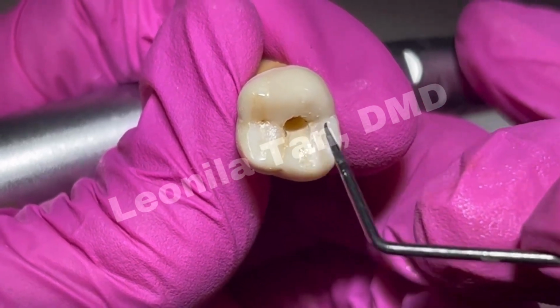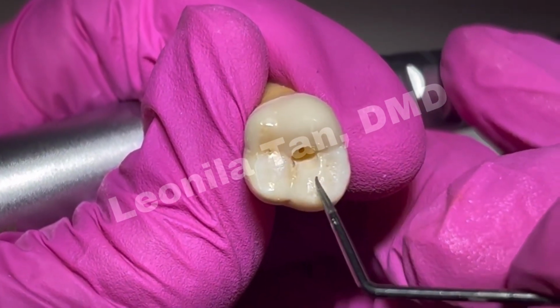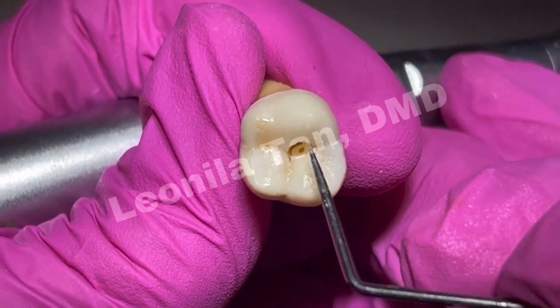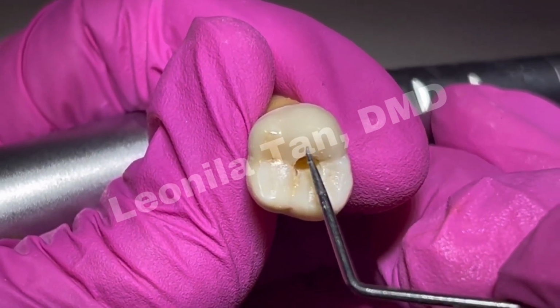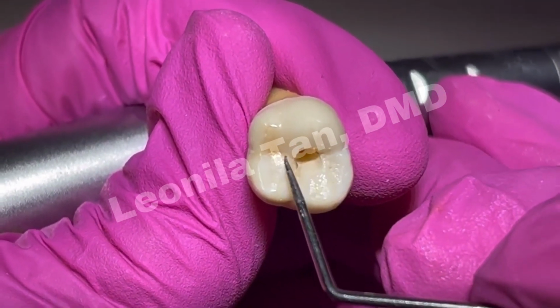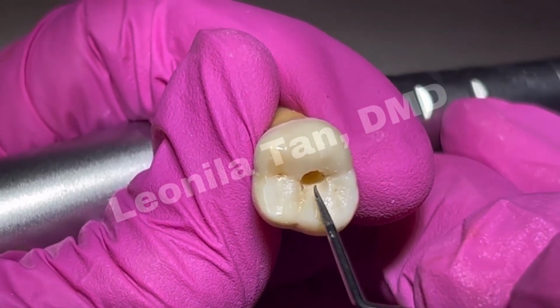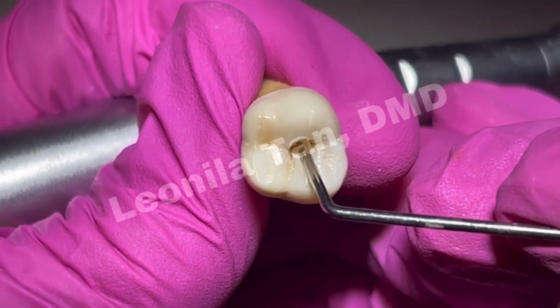Your drawings are all on the mesial side, but some of you have a second molar, so take note, there will be some adjustments to the location of your access prep as you go to your second or even third molars. But your point of entry and the direction of your burr are always the same.